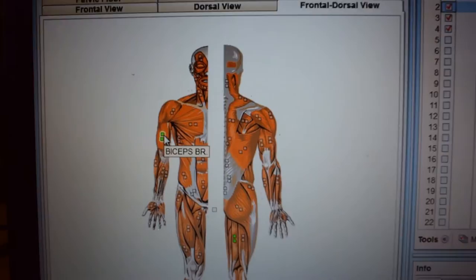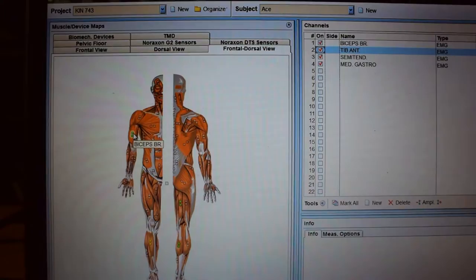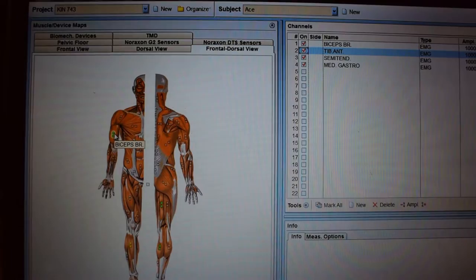Now, I have already got my right bicep prepped with the traditional skin prep method of shaving, abrading, and using an alcohol wipe to clean. So we will select the right bicep.